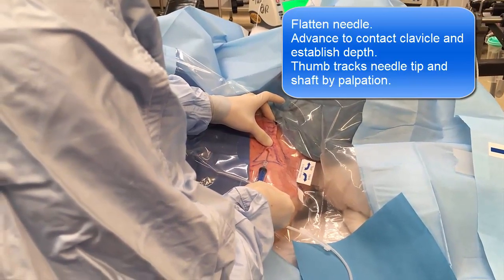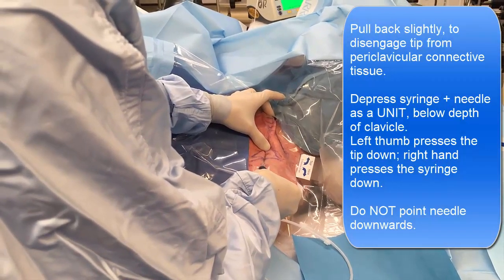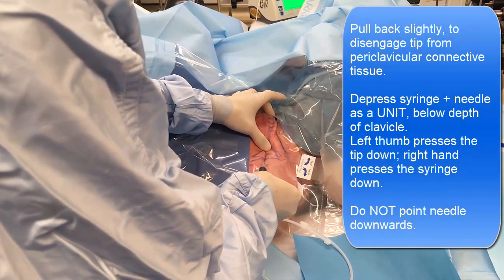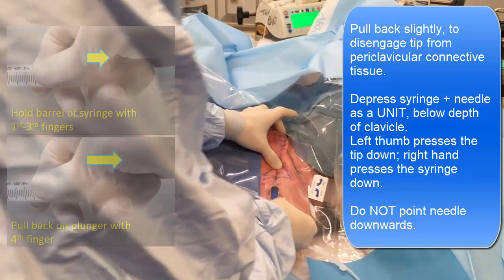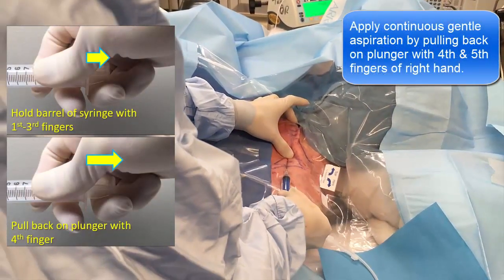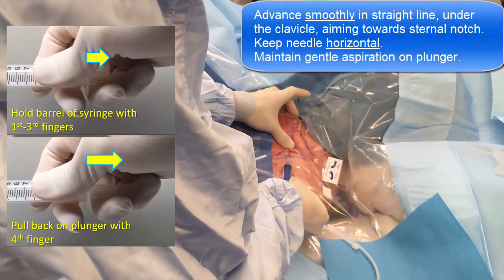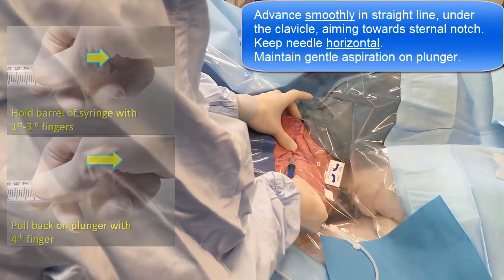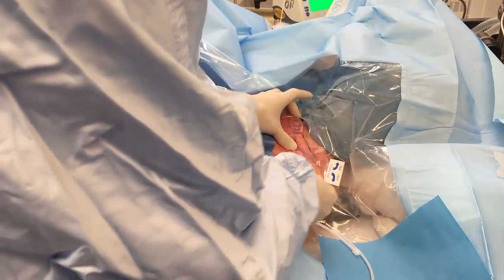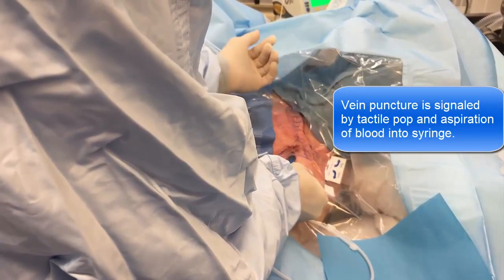So I know what the depth of the clavicle is. Now I push back and then push this down — so I'm pushing the tip of the needle down. I'm pulling back on the syringe with this hand, and then I'm just advancing under the clavicle in a straight line towards the sternal notch. And there it is — I hit the vein.